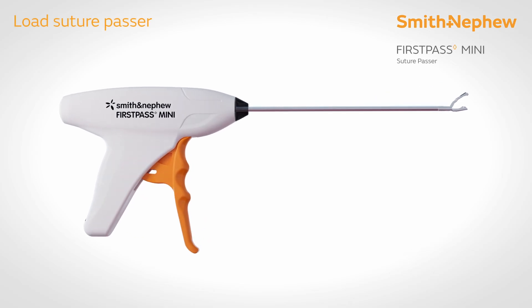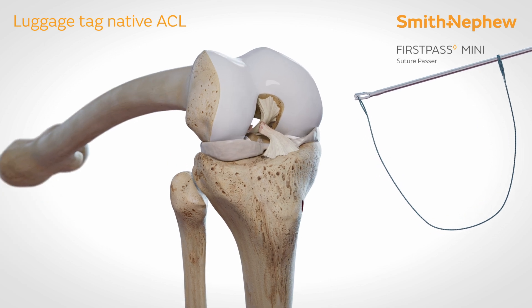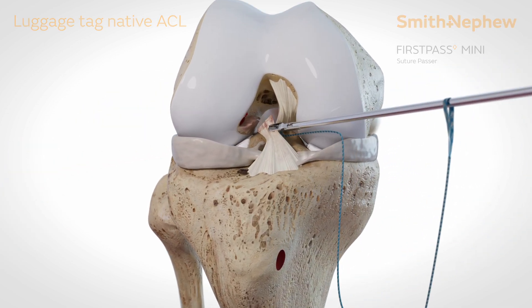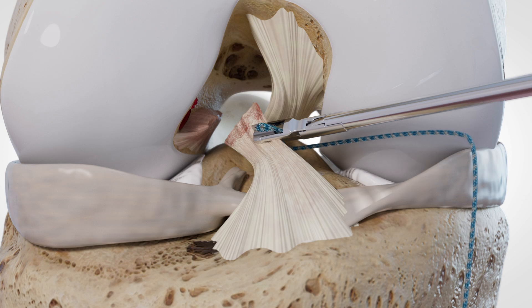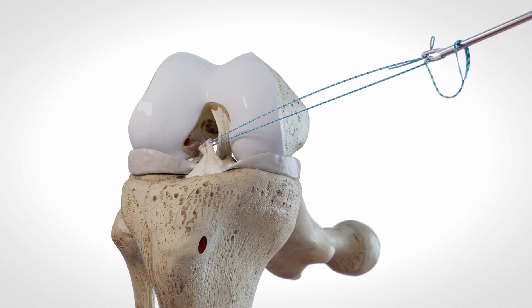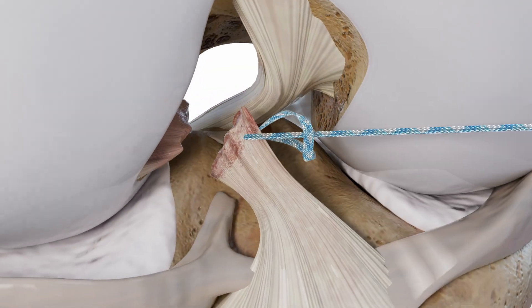Load an ultra-loop suture loop onto a straight first-pass mini. Bring the first-pass mini into the joint and pass the ultra-loop 1 cm distal from the remnant end of the anteromedial bundle. Pull the first-pass mini out of the joint, reducing the ultra-loop down onto the ACL remnant to create a luggage tag.